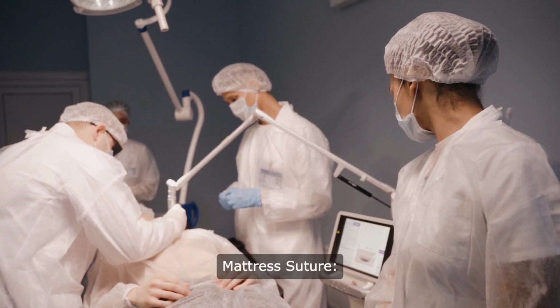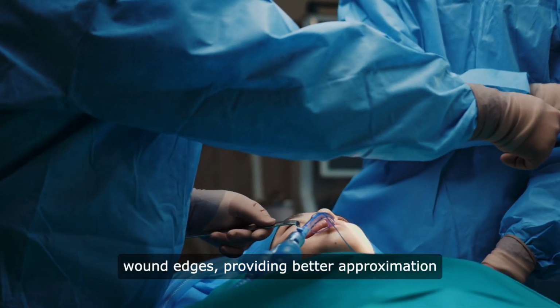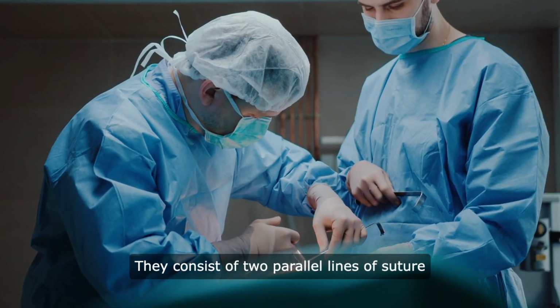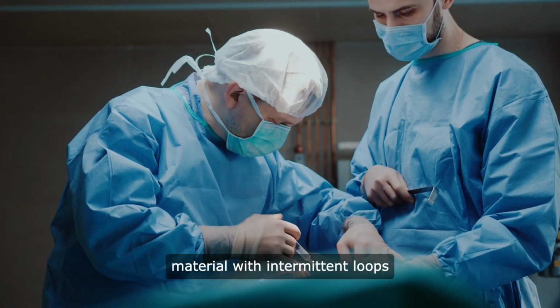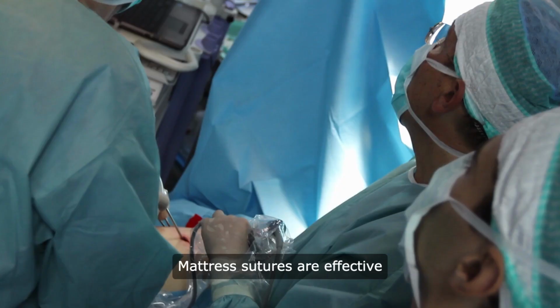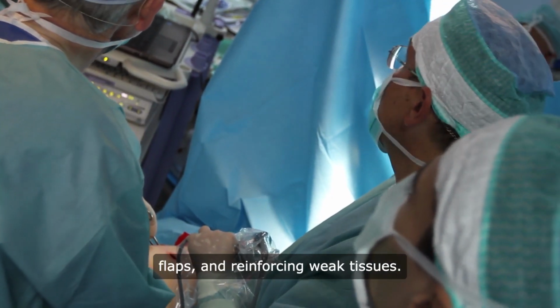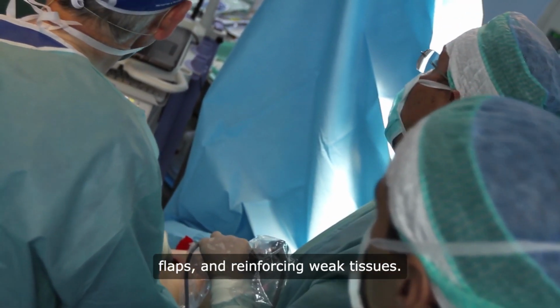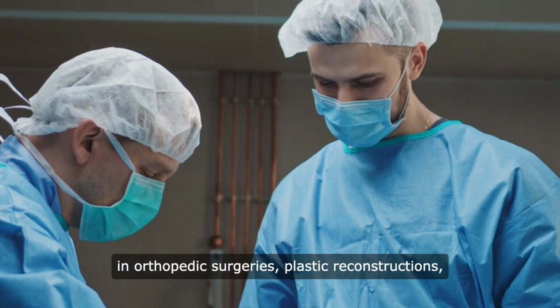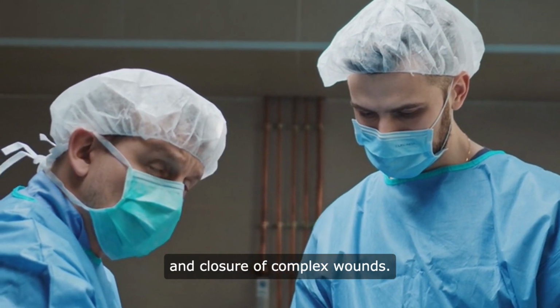4. Mattress suture. Mattress sutures are designed to evert wound edges, providing better approximation and tension distribution. They consist of 2 parallel lines of suture material with intermittent loops passing through the deeper tissue layers. Mattress sutures are effective in closing deep wounds, securing flaps, and reinforcing weak tissues. Surgeons often use mattress sutures in orthopedic surgeries, plastic reconstructions, and closure of complex wounds.